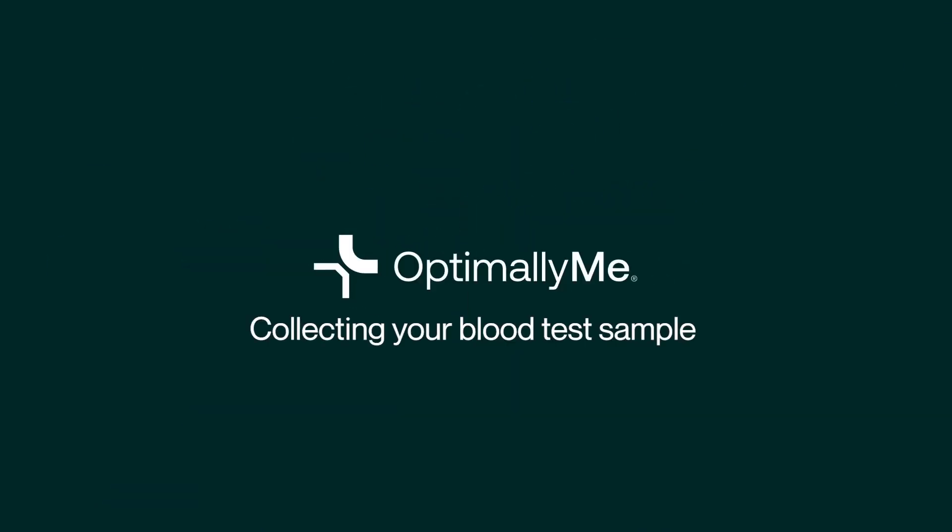Welcome to Optimally Me's guide to collecting your blood test sample. We'll walk you through this quick and easy process.